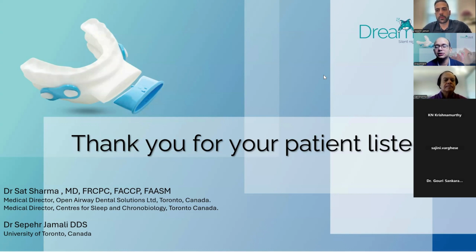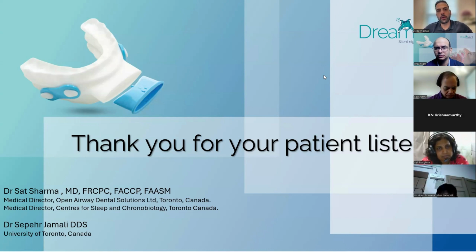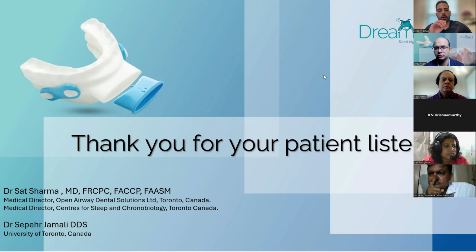Then we have Dr. Rahul who's asked, is this appliance only for patients who mouth breathe? So no, again, the appliance doesn't care if you're breathing through your nose or through your mouth, but because there's a big correlation between the people who have obstructive sleep apnea with the higher nasal resistance and the chronic nasal congestion, especially in the supine position, they can see bigger, more effective treatment. But it's not only for people who breathe through their mouth, because while we are advancing the mandible forward and removing the obstruction from the back of the throat, even if the patient is breathing through their nose, that obstruction should have been relieved so they can breathe through their nose even.